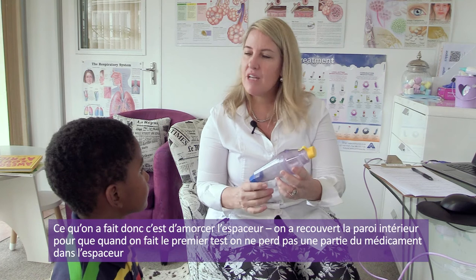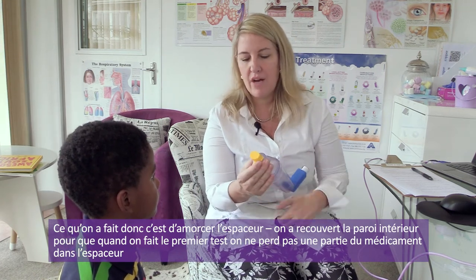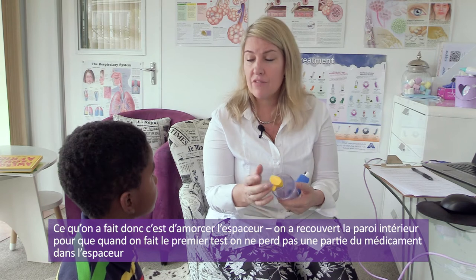Okay, so what we've done is we've just primed it. So we've coated the inside wall of the spacer device so that when we do the first blow, we don't lose some of it into the actual device itself.